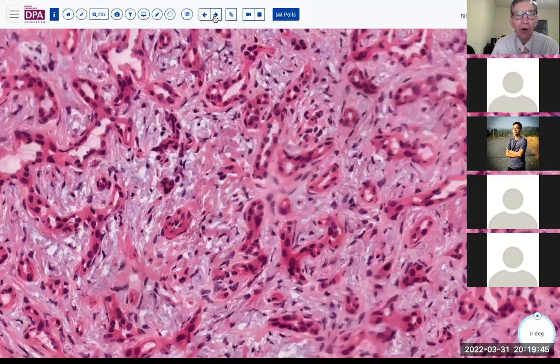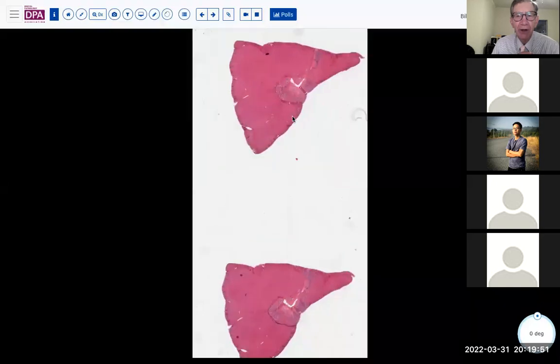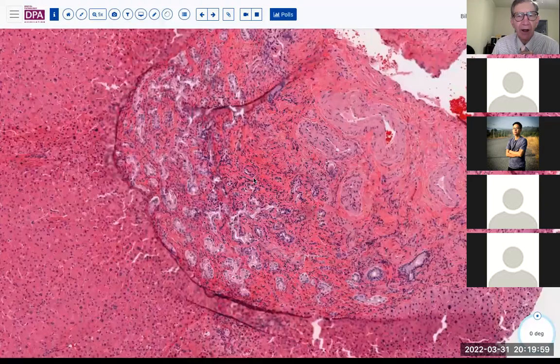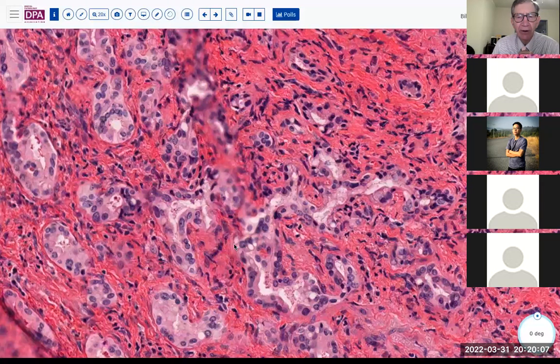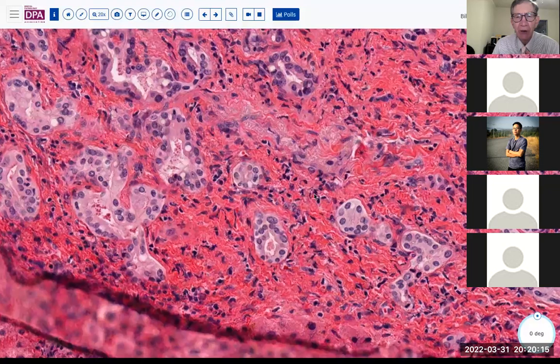So that's the little warning with bile duct adenoma. We'll look at another example here. I think this is actually a similar one. You see just a few millimeters. Here you can see this is nicely fixed. You can see the nuclear details. And although there's a bit of wanderingness to these nests and tubules, again, you see how uniform the nuclei are.